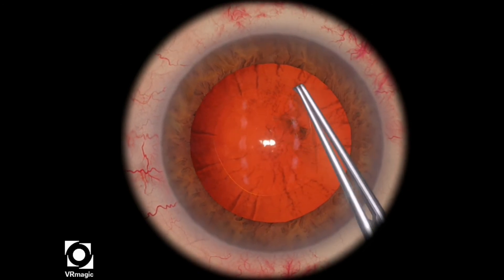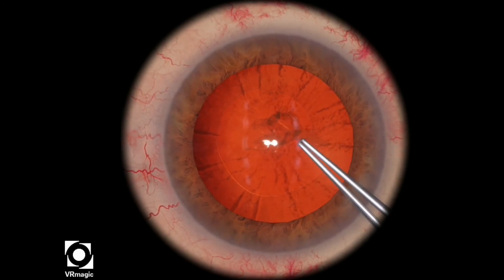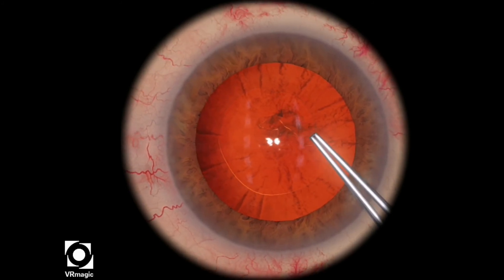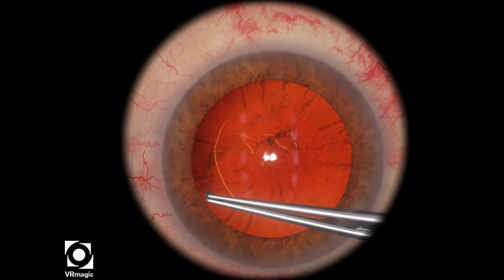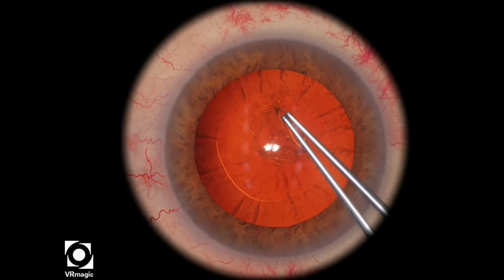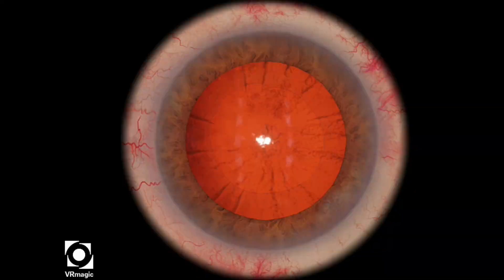I pull and pull, just creating a Capsulorhexis in the regular fashion. There's a little sliver at the end left that will make the rhexis fully round without a notch where you've performed Little's rescue maneuver. Then you pull, and that looks actually quite round, a little bit bigger than normal.